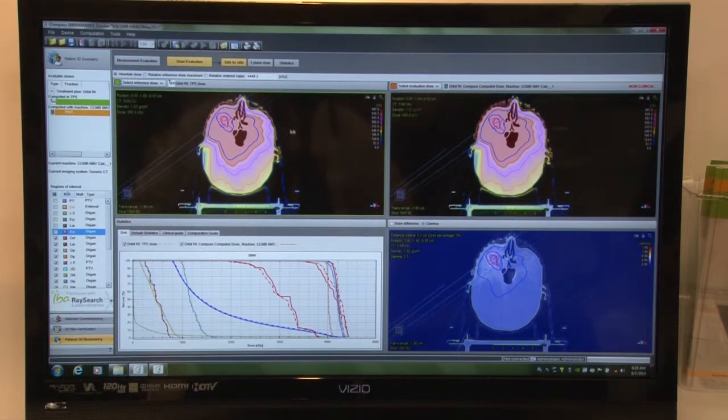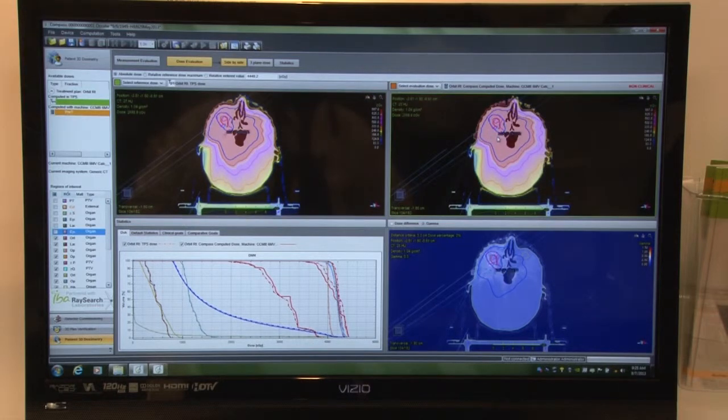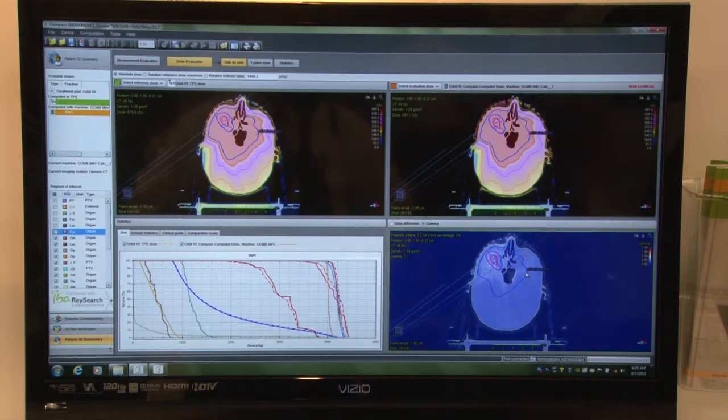So in this case, we could have the left quadrant being the TPS dose. In the right quadrant here, we have a measured fluence and calculation through our collapse cone algorithm. We have the ability then to compare those two as well.